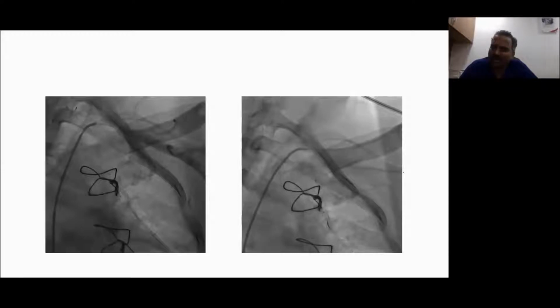In those cases, what we can do is take a non-selective angiogram with the catheter in the subclavian origin and with a BP cuff on the left arm, wherein pressure is raised 20 mmHg above the systolic pressure of the patient, so that you are occluding flow downstream and more and more contrast will enter into your internal mammary artery. That is one technique. Another technique is to send a PTCA wire with a good loop into your LIMA, internal mammary artery. Once the wire has gone in, you can push your catheter over the wire into LIMA. This is another technique which we can use.